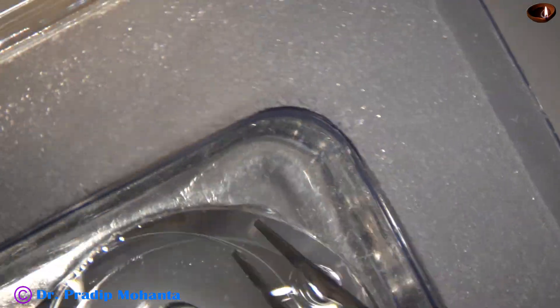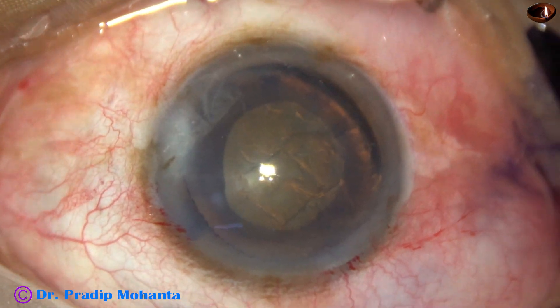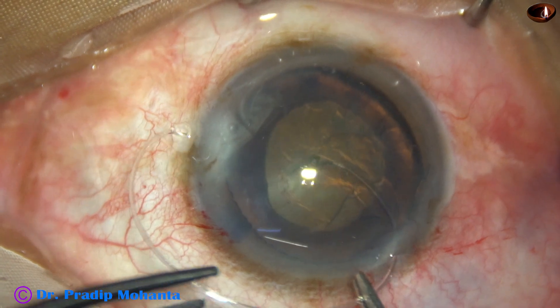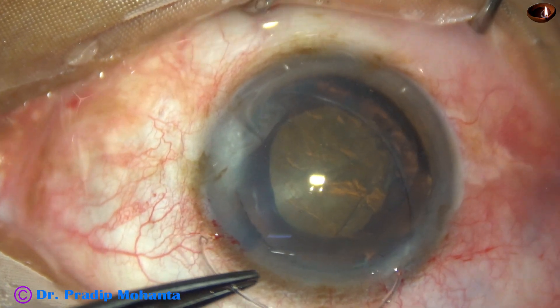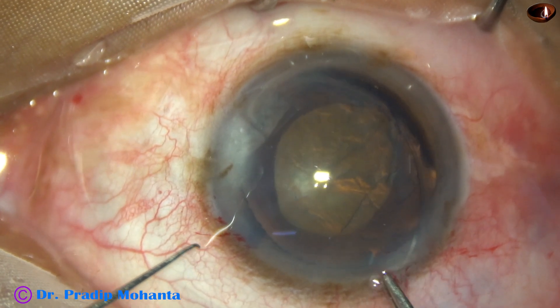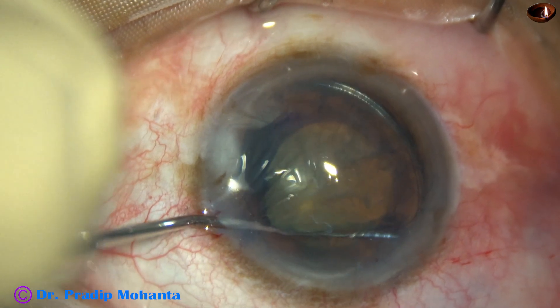Since the defect is 4 clock hours — quite significant — I am planning to place the CTR now, right after separating the capsule from the underlying cortex. The CTR is taken. This is a McPherson's forceps in my right hand and another forceps in my left hand. The CTR has gone into the capsular bag; the leading end has gone into the equator. Gradually the CTR is advanced, and with the help of a Sinskey hook, the CTR is placed in the capsular bag.